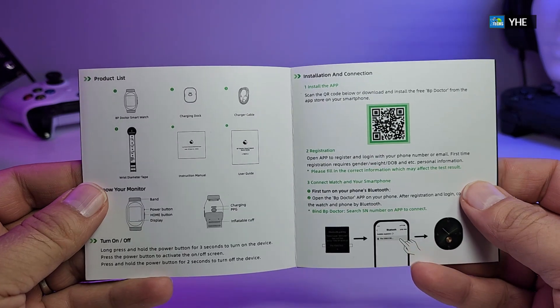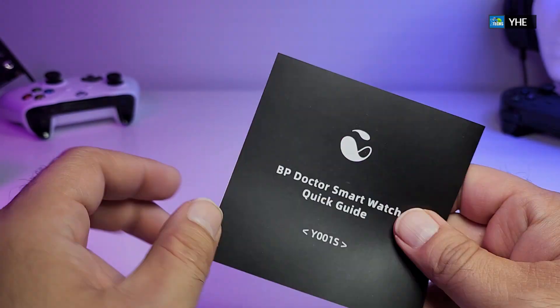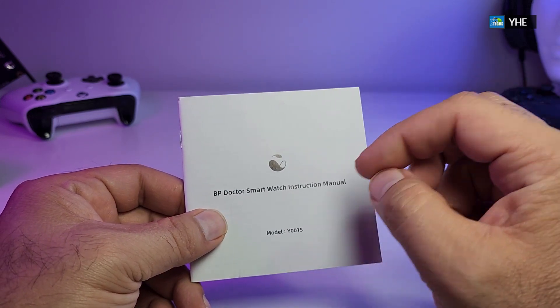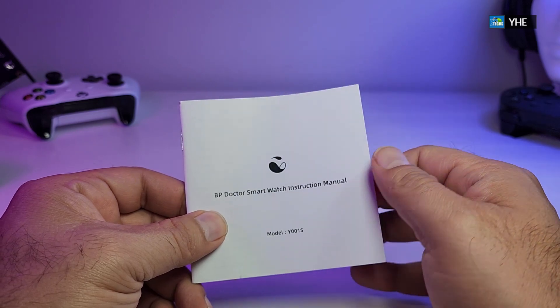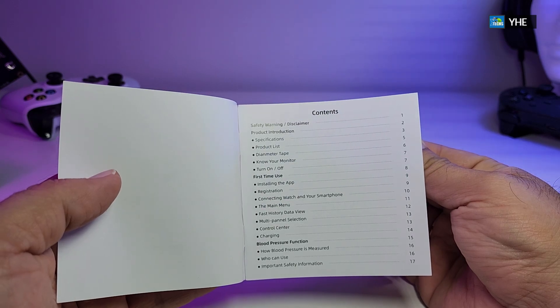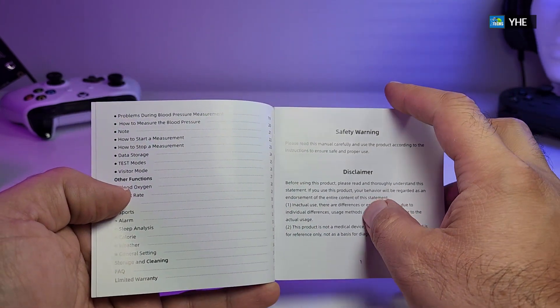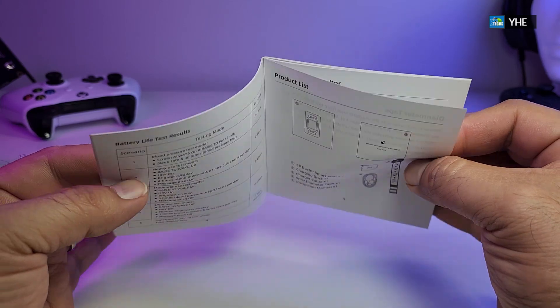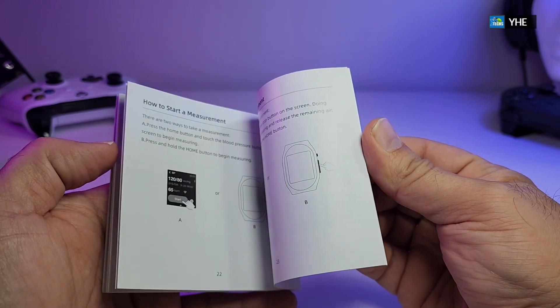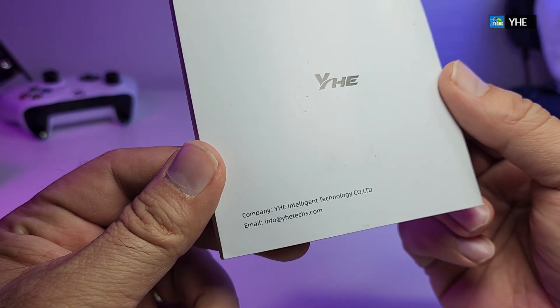On the back of the guide there is more information about how everything works and also how you can get the app — all inside the quick user guide. It also comes with a detailed user manual, the BP Doctor smartwatch instruction manual. The model number is at the bottom. Once you open it, the table of contents covers how to process it the first time, second time, blood pressure usage, and everything else. All the information you require is in English, and they also have their email address written at the bottom if you need support.